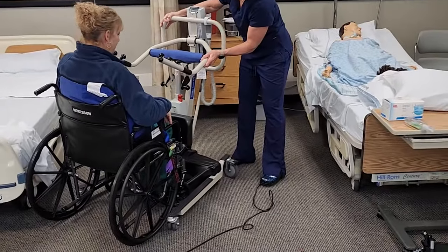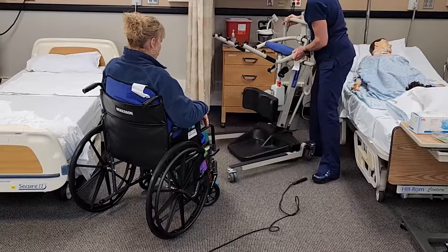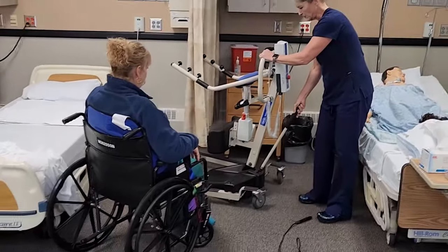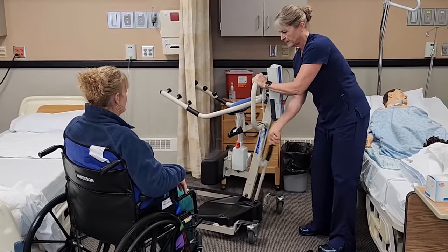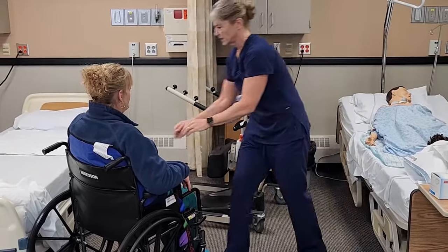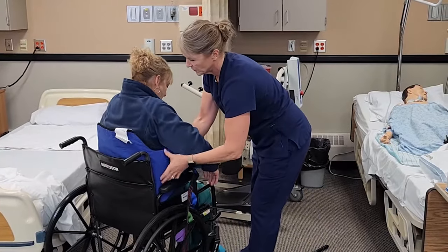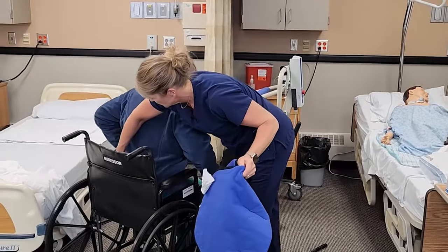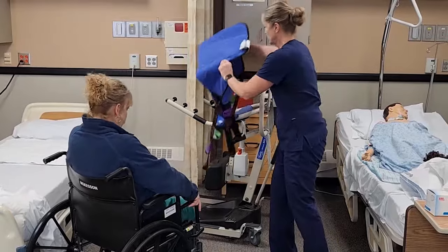I'm going to have you pick your feet up — we're going to go slowly. Make sure we don't roll on our feet. To open and close the legs, we pull this lever back towards us. I'm going to get your sling off. Have you sit forward a little bit. It's always good to help them pull their shirt down after they've been up in the lift because that usually sneaks up a little bit.